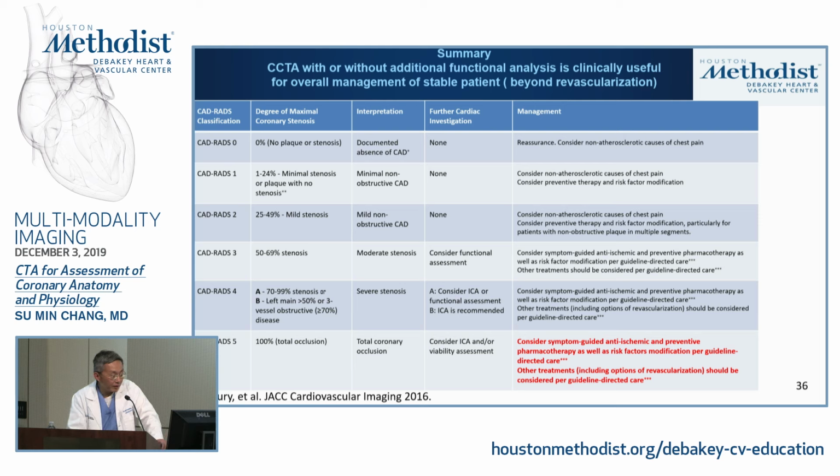I think this is a very reasonable thing for the fellow to read clinically because really it gives you some more balance and a balanced view, and also gives you some direction in what to do when you read a coronary CTA.